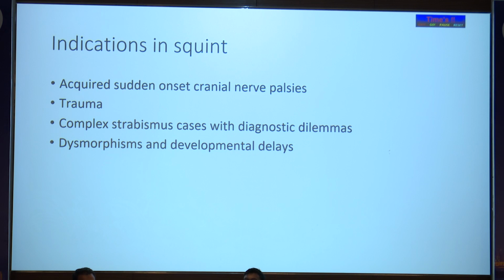In complex strabismus cases where there are diagnostic dilemmas, dysmorphisms, and developmental delay, whenever you want to plan your surgery, if there is any doubt and the strabismus is complex, you can do imaging. Otherwise, for research purposes also, you can do the imaging.